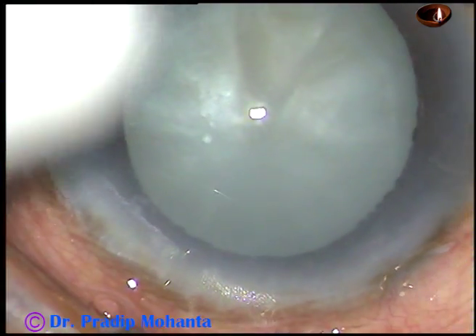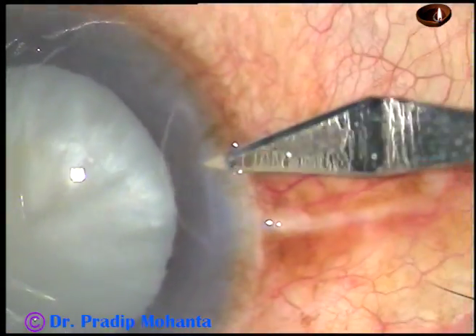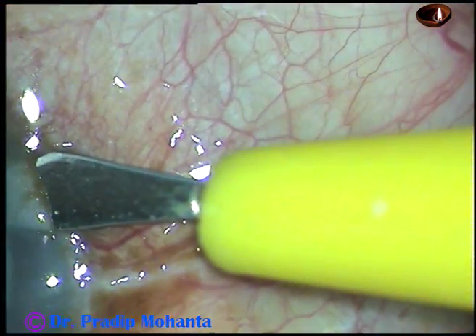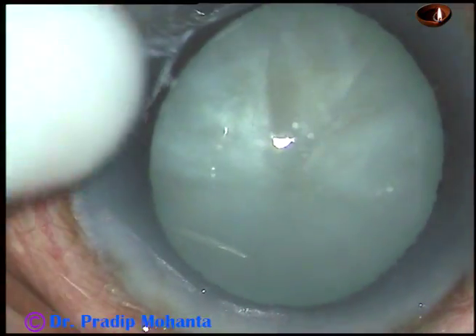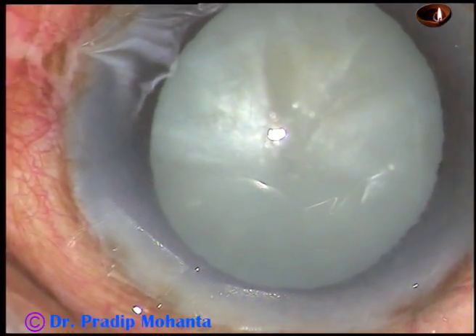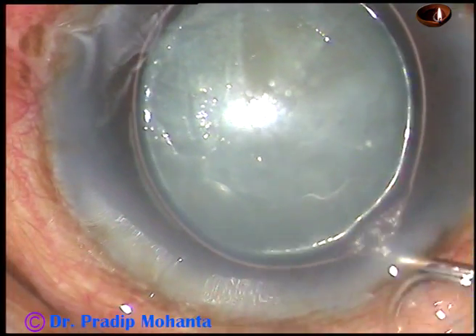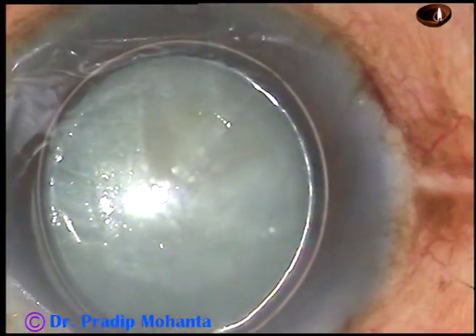This is the main incision, and this is a paracentesis on the right side of the main incision, about 3 o'clock hours away. Now I am going to inject an air bubble. The anterior chamber is very shallow and very little amount of air could go in.